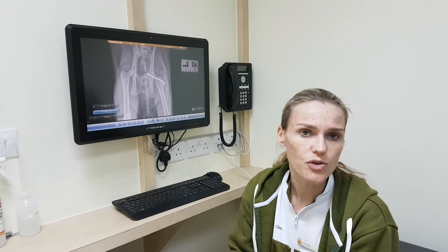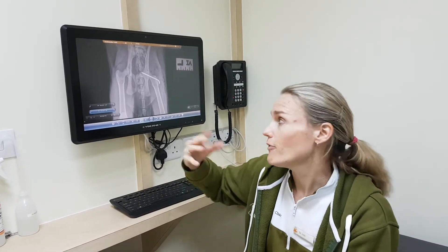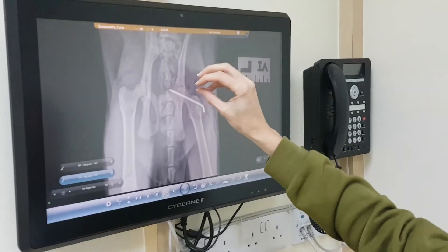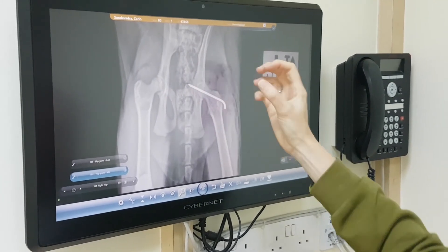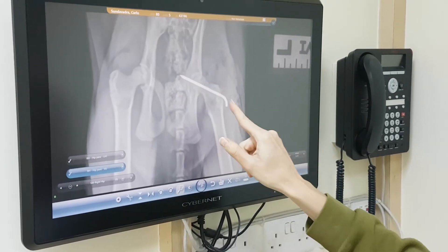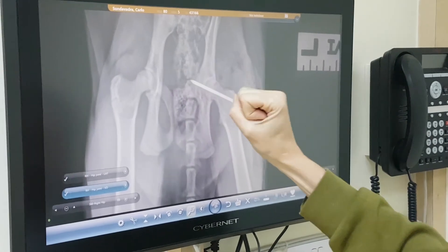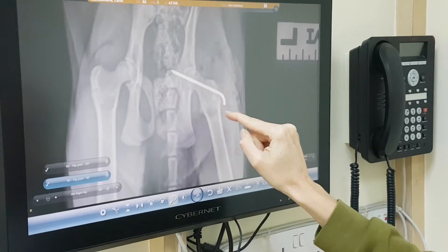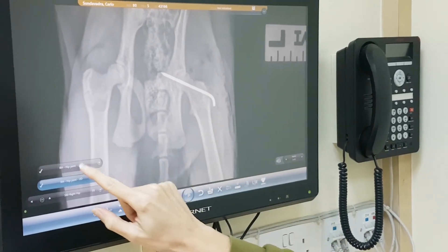We've just done surgery on Carlos. He's recovered well, and I wanted to show you the x-rays to show you how it was repaired. If you remember from before, the femur head — the socket was sitting out of the socket. And now if you look here, we've got the femur head, which is this little round area here, and the socket. Everything is back in place. It's nice and snug in there. And we've got this big pin here that is actually keeping that in place.